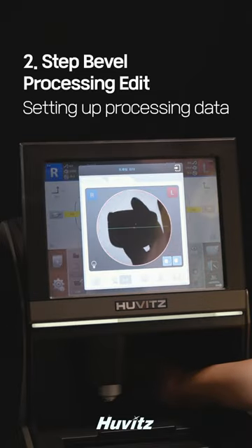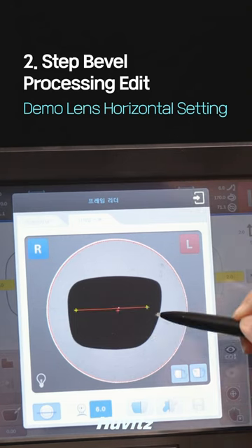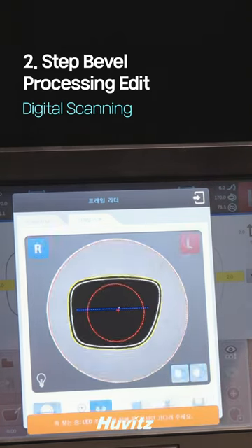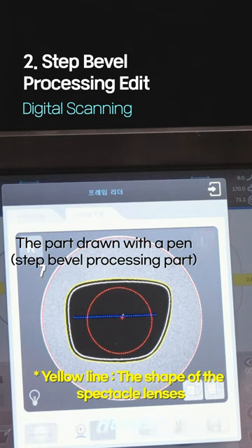On the HAV 910, place the demo lens on the support, set the left and right sides and curves, set the horizontal, and perform a digital scan. The white line is a line drawn with a water-repellent pen, and it is the part that needs to be processed with a step bevel to the depth from the groove of the frame to the back.